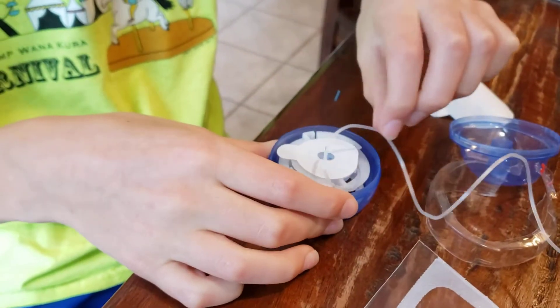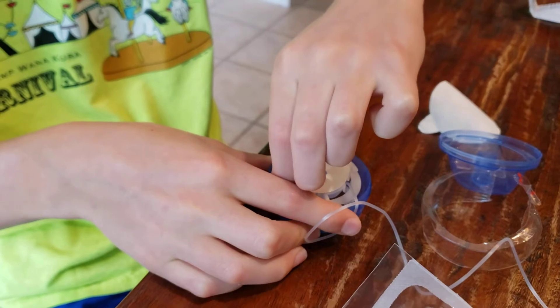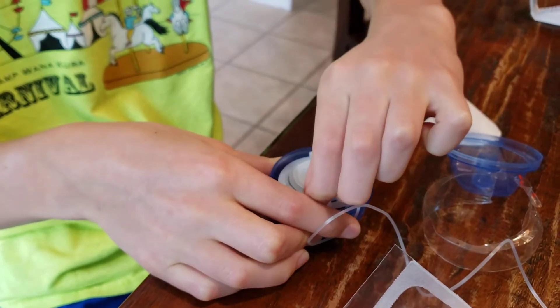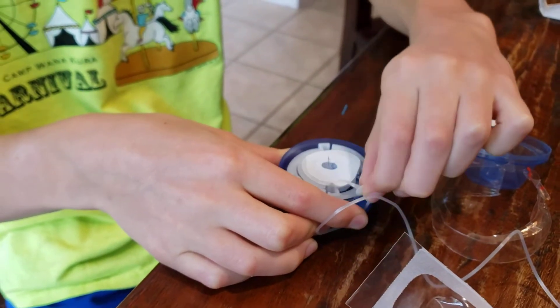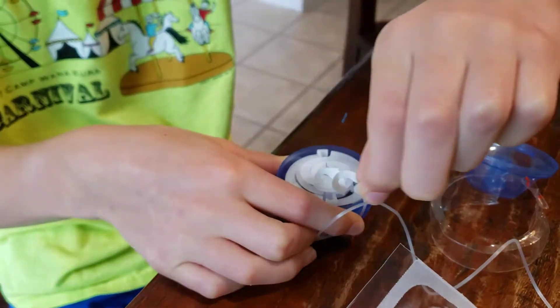Did the insulin come out? Yep. There are two ways you can do this: you can peel this off now, or you can pull it back, re-cock it, and then peel it. I like to peel it and then cock it.